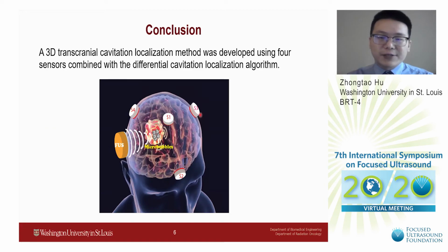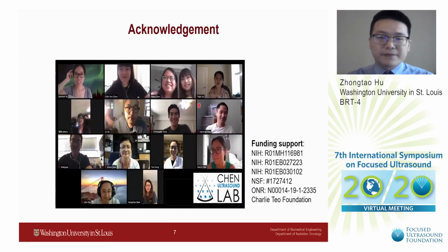A 3D transcranial cavitation localization method was developed using four sensors combined with the differential cavitation localization algorithm. Our future work is to further validate this method and assess its performance by in vivo experiments.